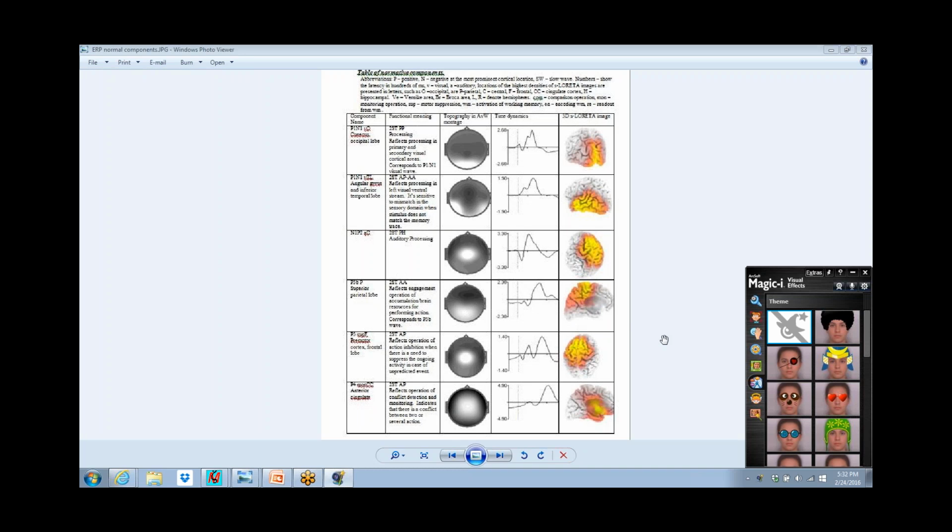No, we do it on the components themselves as well. The Loreta actually works very well with ERPs. You get a visual event-related potential. The 100 millisecond stuff hits at the back of the head. You do auditory, you can pick up the Loreta source actually showing the initial sensory arrival in the auditory cortex.